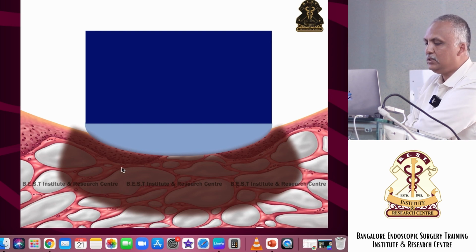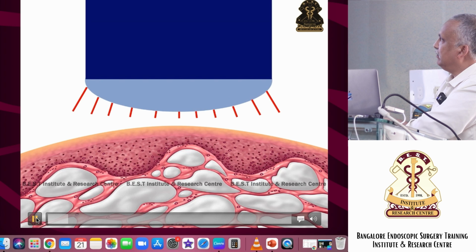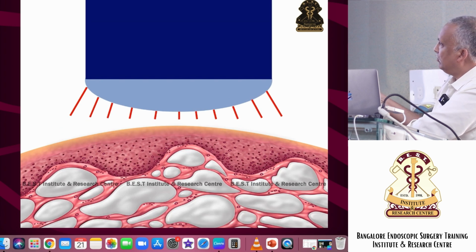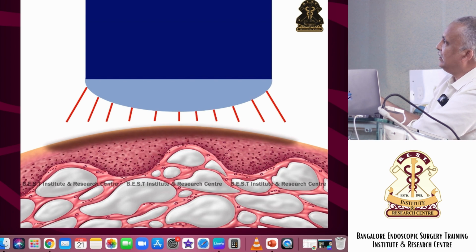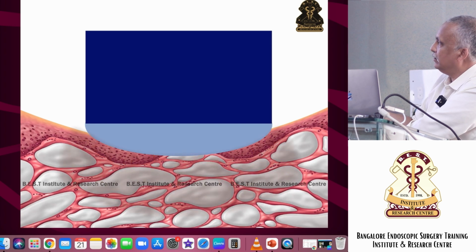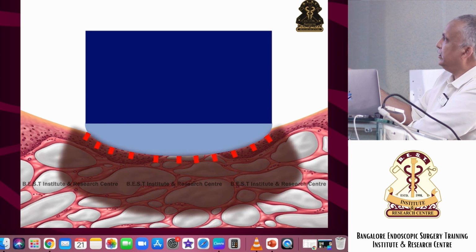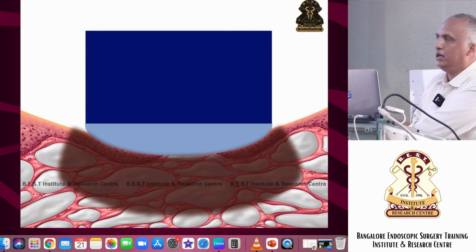Okay. So based on what you want to coagulate, you have to use it that way. You want only the surface, you don't want the deeper liver to get burnt. So don't touch it, come 1 millimeter away from the tissue, and use it. But if you have a big vessel in the liver bed, a venous sinus is there and it is bleeding, then you press on it and then coagulate, then a deeper zone will engulf the blood vessel that is there and it will stop the bleeding. Okay.